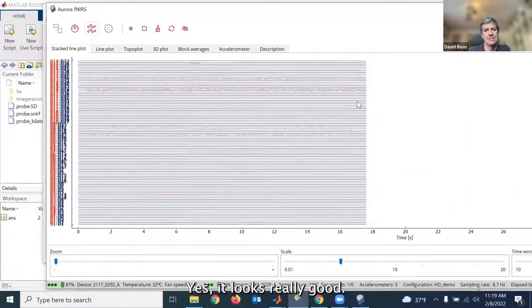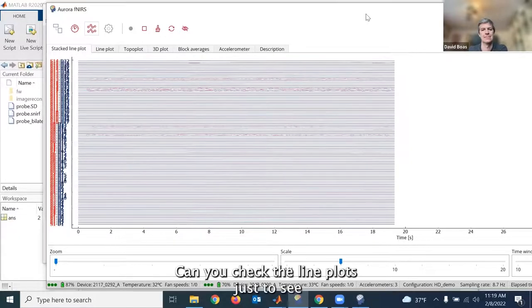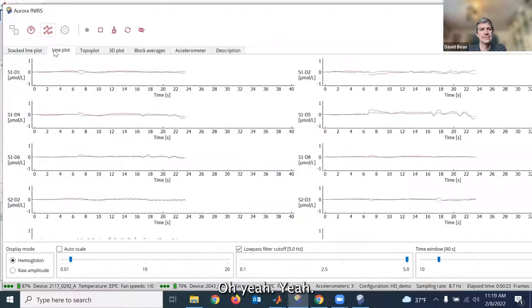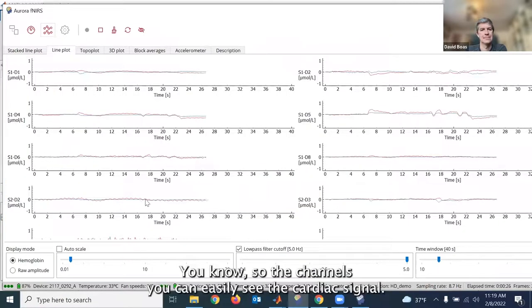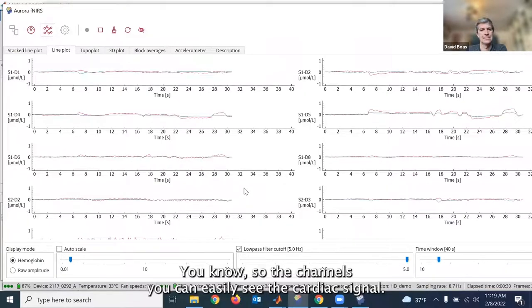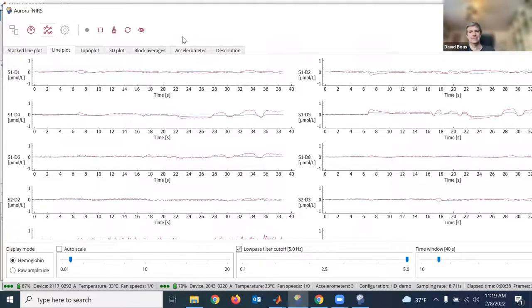After optimization, recording is started. The channel display shows most channels working well with only a few bad channels — impressive given no hair preparation was done. In the line plot view, the cardiac signal is clearly visible in several channels, demonstrating good signal quality even with Yuan Yuan's dark hair, which makes light penetration more challenging.